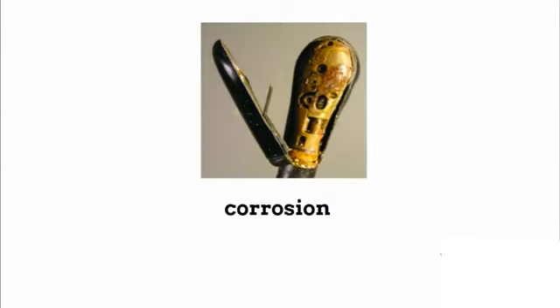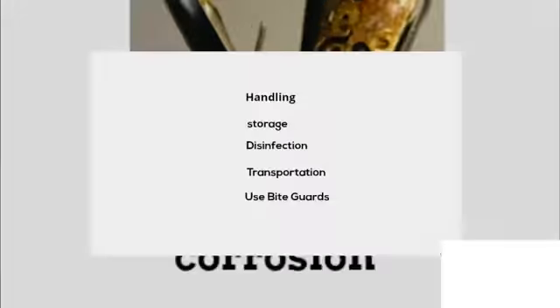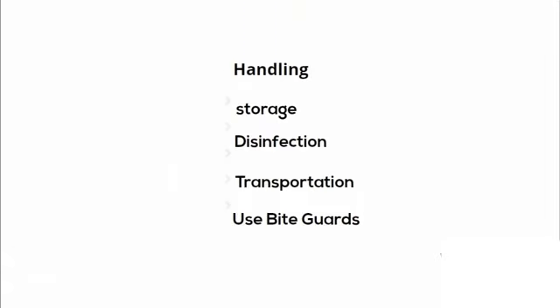Corrosive effect of fluid infiltration at the tip of the T-probe is another common damage. To avoid such damages, do proper handling, storage, disinfection, and transportation of your T-probe, and use bite guards during scanning.